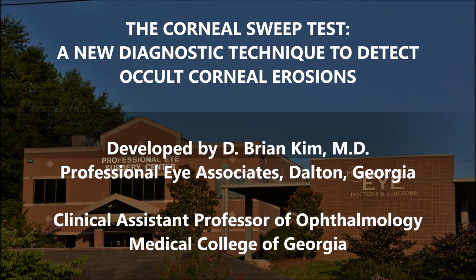However, this approach is grossly inadequate because sometimes patients have corneal erosions and there are no signs whatsoever, and sometimes no history of trauma. There is a simple and easy way to directly detect these erosions without any equivocation and wondering what's going on. And most importantly, you'll be able to treat these patients with a superficial keratectomy and cure them of their problems.